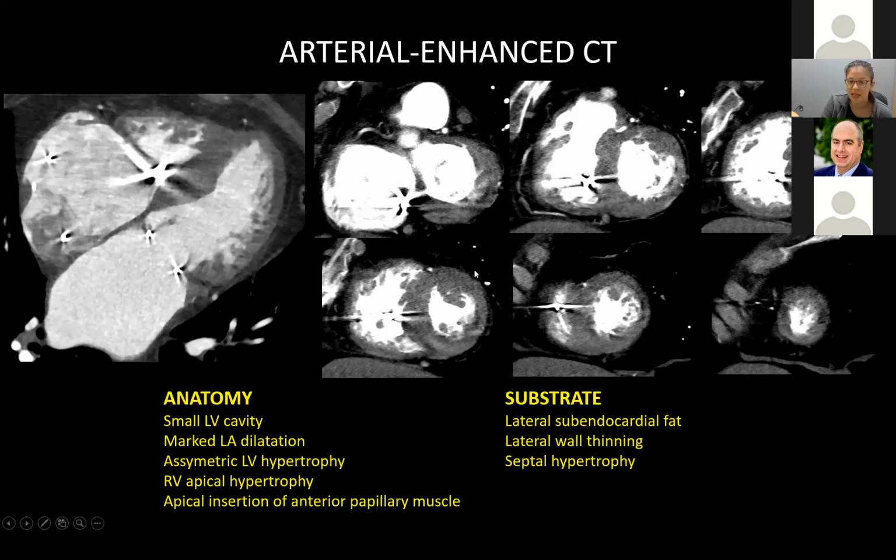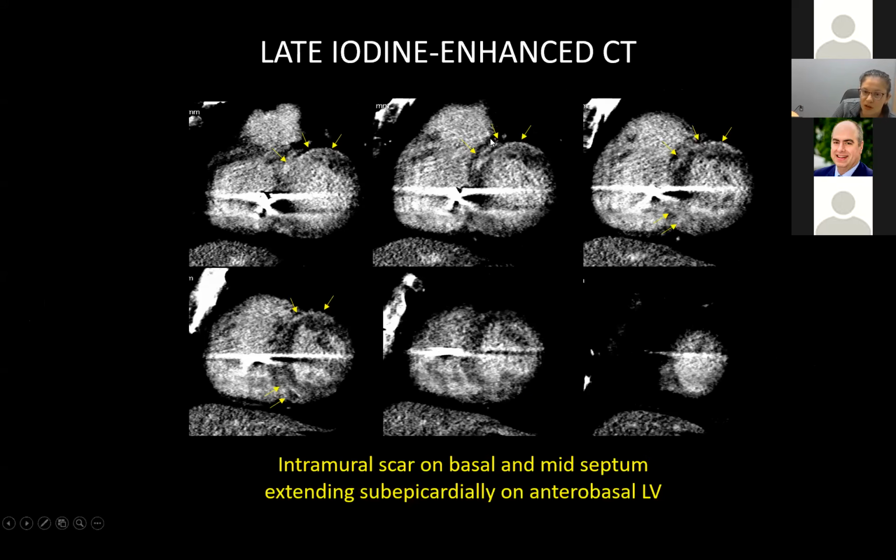And CT has a lot of advantages. It can be a little bit easier to get good fidelity images in patients with devices. You can see that there's still some problems with artifacts from the leads and such, but in some of the areas where we're looking for late enhancement, you can actually still see the mid-myocardial enhancement that you might be interested in your patients with non-ischemic cardiomyopathy.